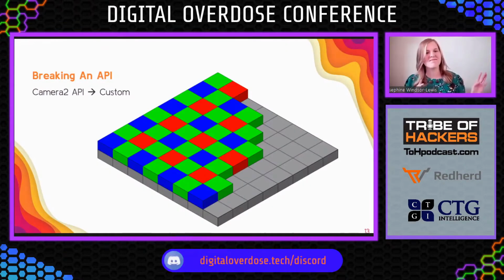It sounds a bit confusing, let me break it down. This is what the inside of your camera looks like. Not exactly. Technically, this is a scientific representation of the process, but it is nearly as exciting. It's a Bayer matrix. It is a series of light sensors, blue, green, and red, laid out in a grid. Four of these together, a little square, forms a pixel. That's the basic component of an image. It's an average of the blue, green, and red color readings. You can see that there's twice as many green as any other color.